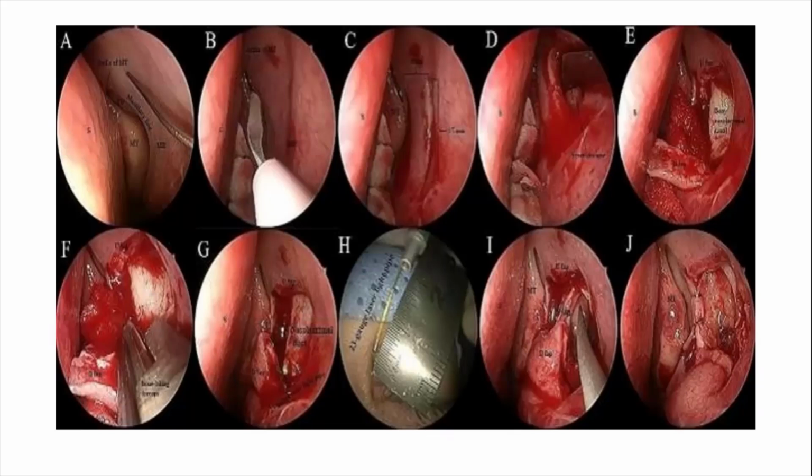Conventionally, you infiltrate and make a flap here. This is the axilla, the attachment of the middle turbinate; we call it the axilla. Your sac fundus is here, so your incision must be like this. This exposes the uncinate process, only to expose your nasolacrimal duct. Your dissection starts from down to up to reach the sac fundus. I will show you my video after that, so you can follow this endo anatomy and relate it to my video next.